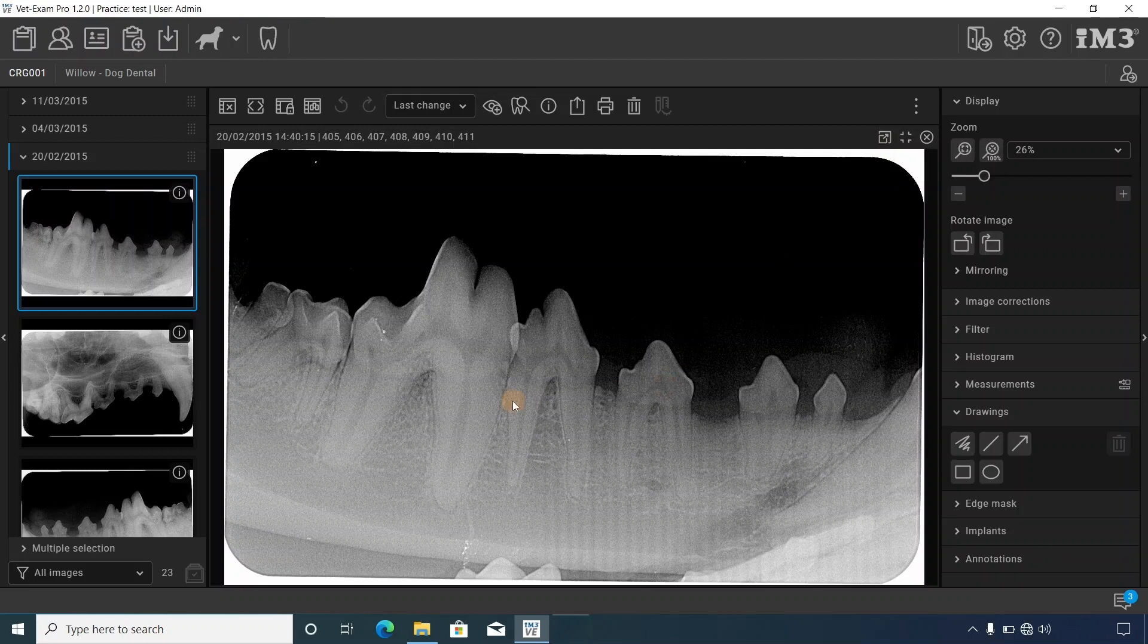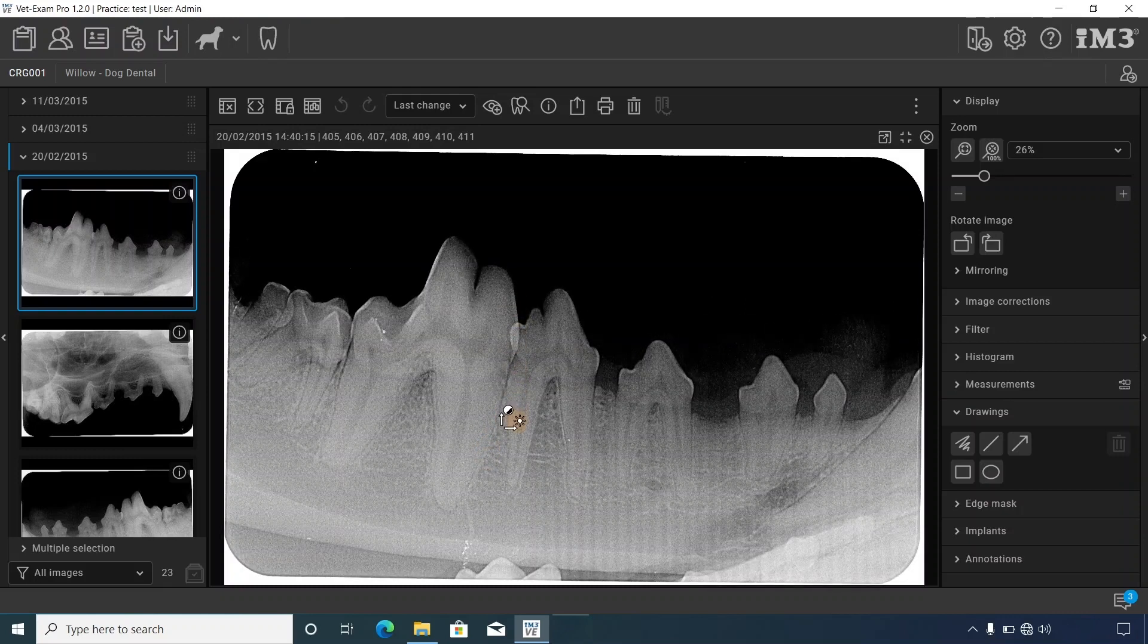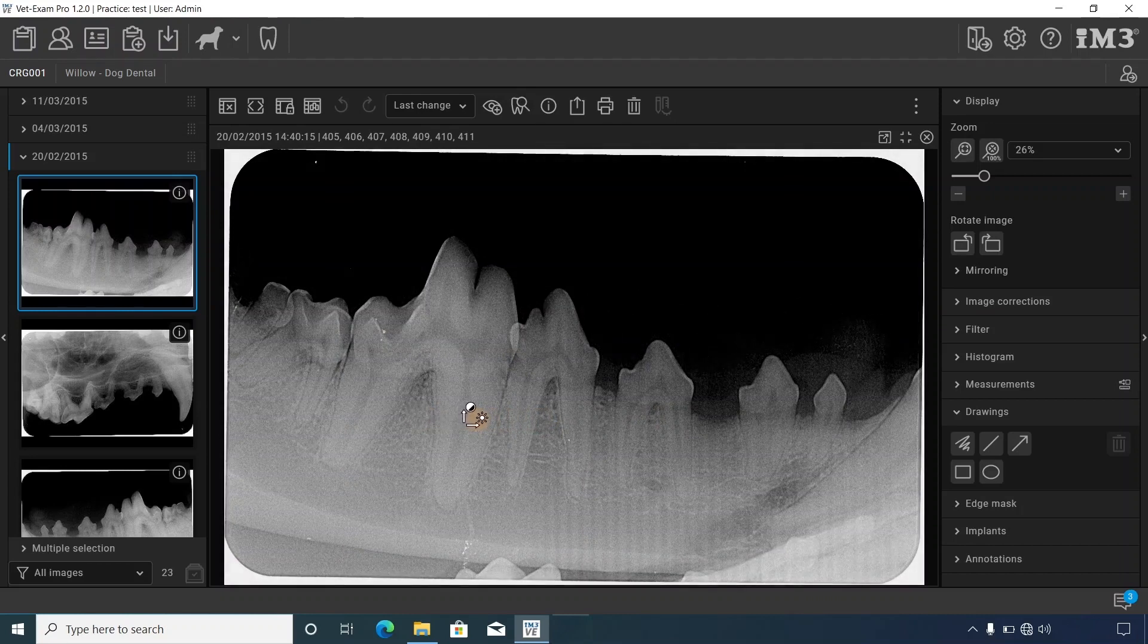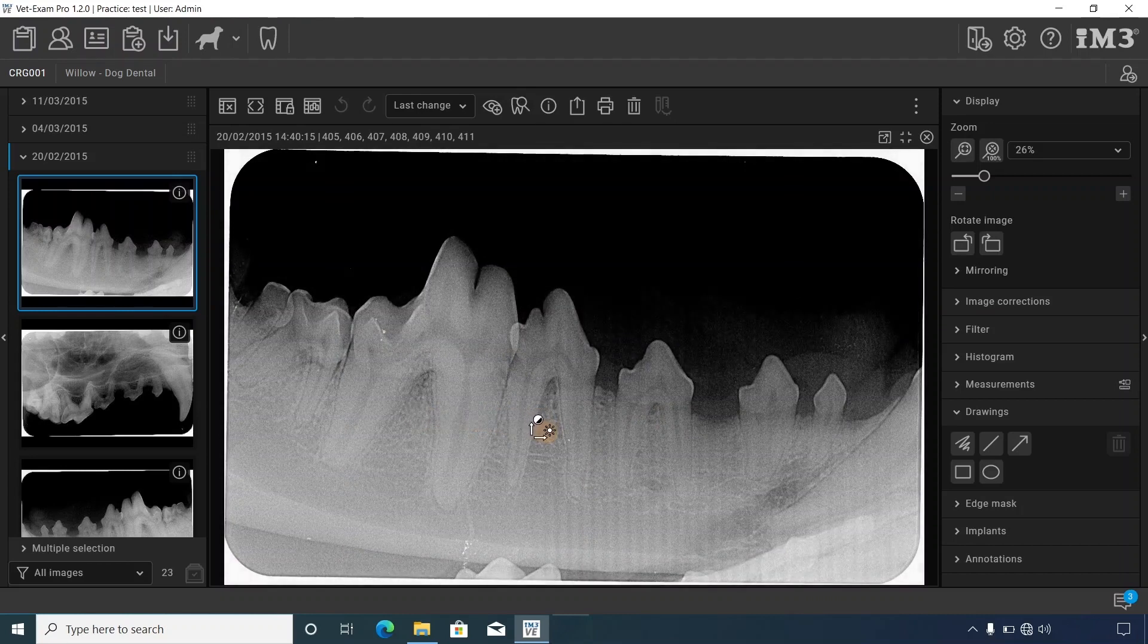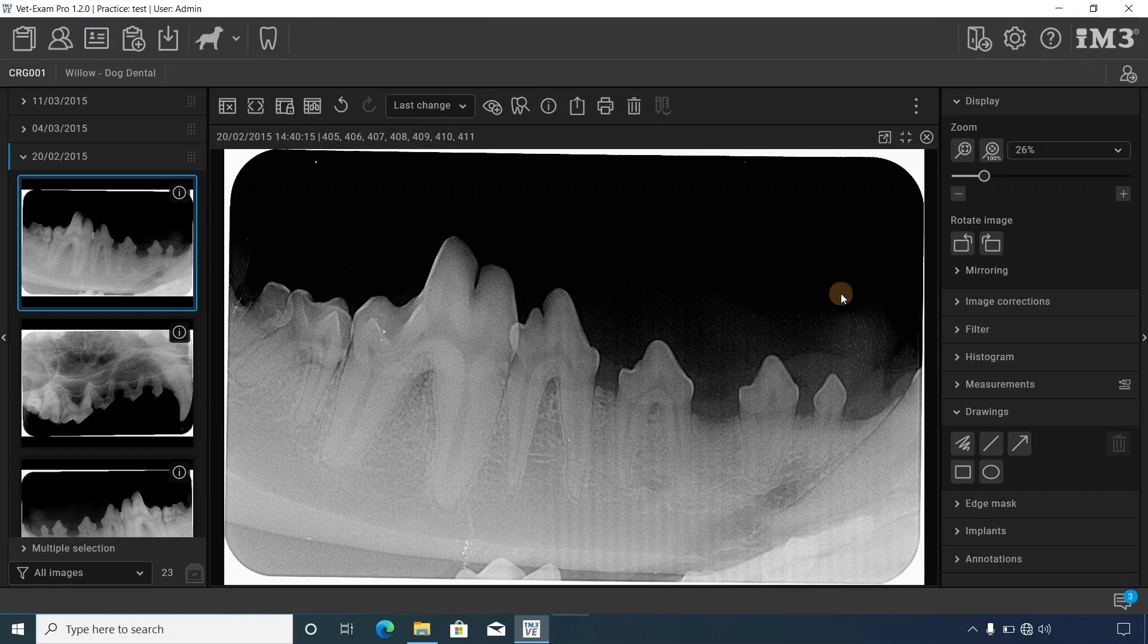To adjust contrast, move the mouse up and down. To adjust brightness, move it right to left. The toolbox on the right provides these control options.